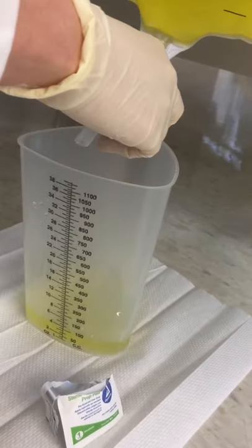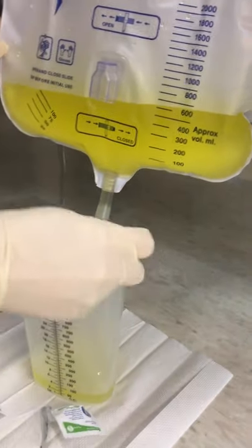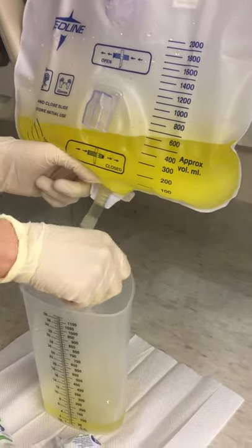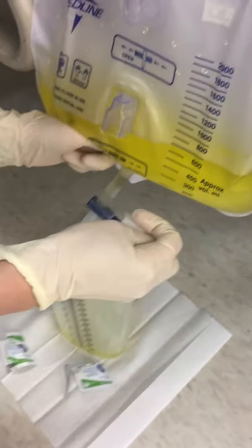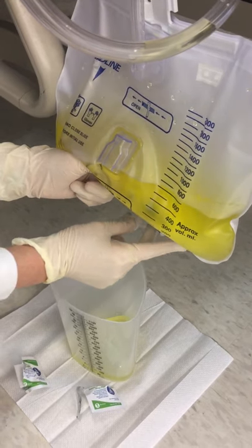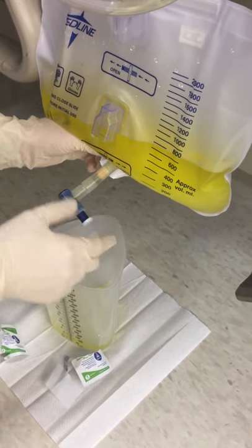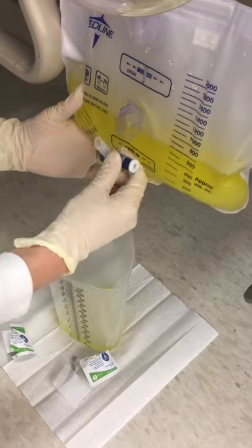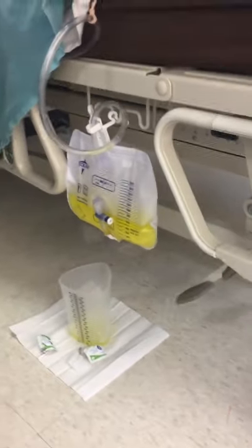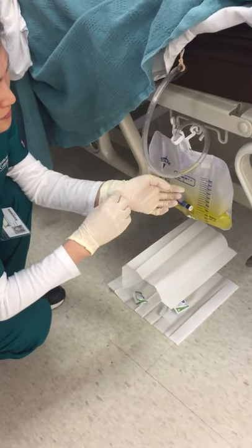Empty the whole bag from top to bottom. Pull the spigot back, then cover it with the barrier paper towel using the one-glove technique.